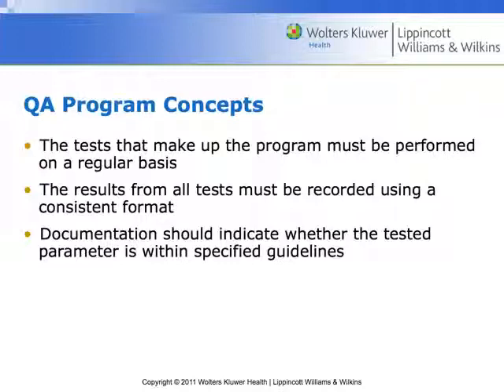A lot of times we have daily system tests that the CT scanner will just put itself through. You initiate the test and it does its dose check, or it does its phantom check test. And those are recorded typically on the system, or we may just document it separately from the system. We may write out and make some screenshots, make some measurements, and write down what our measurements were. And then those will be fed into specific guidelines.